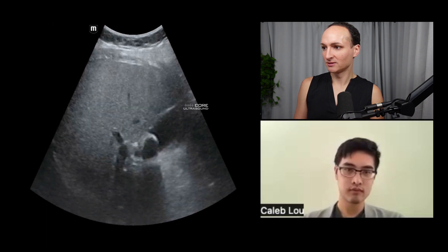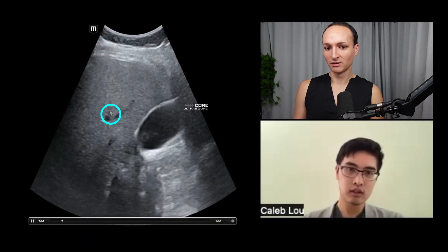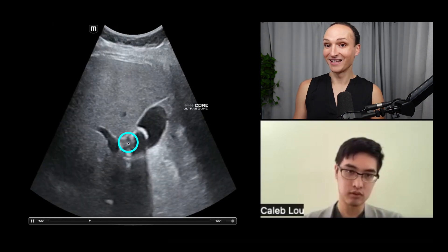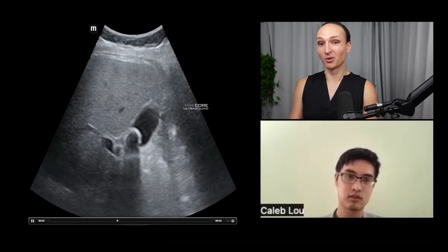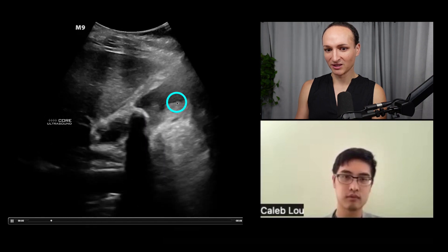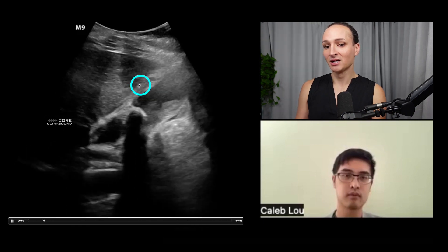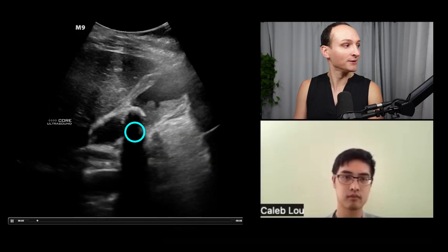More bread and butter — this is liver and gallbladder with a big stone in the neck of the gallbladder and shadowing. Shadowing is important because it helps us identify stones versus polyps. This next patient is more diseased — we're seeing sludge, and the gallbladder wall is quite thickened, which is another finding of cholecystitis. So we have sludge, a big stone impacted in the neck, and a thickened wall — that is cholecystitis.